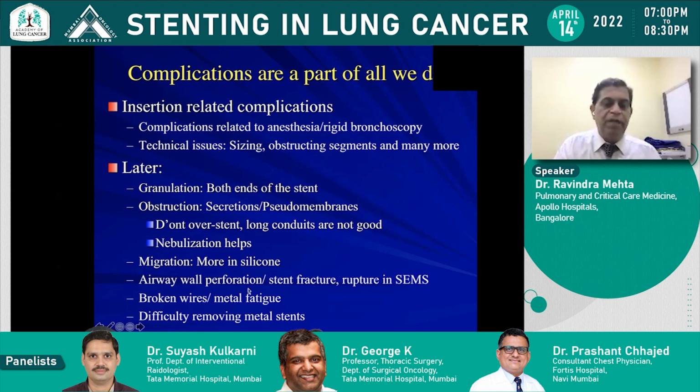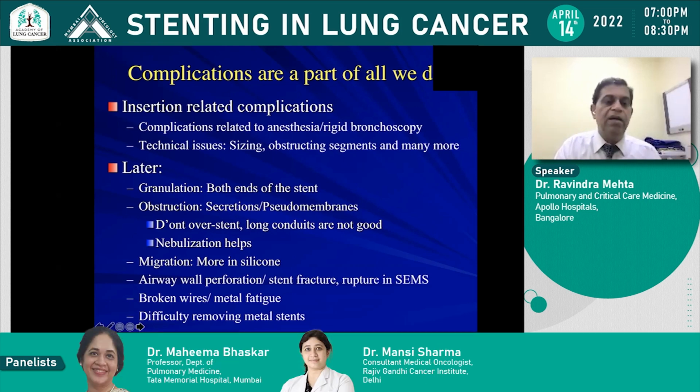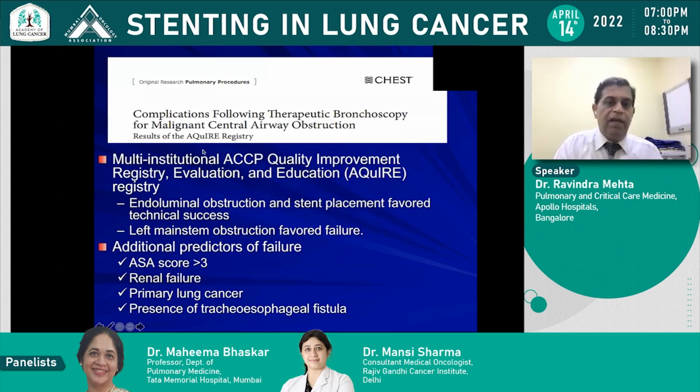Migration is a problem. Stents are like mechanical devices. They're subject to technical issues. And if you have to take these out occasionally, it can be a problem to take out metal stents because they tend to marry the trachea with a lot of sticking over there.